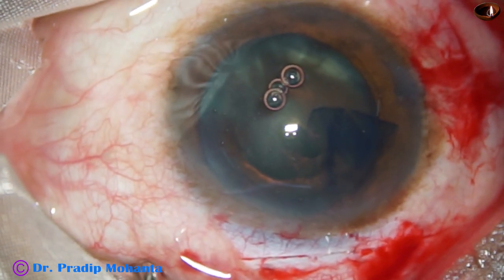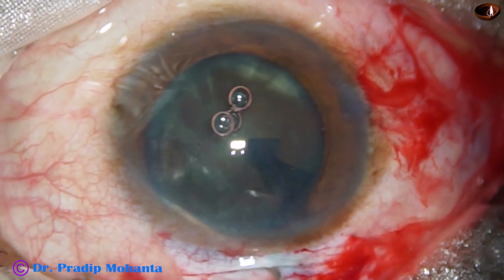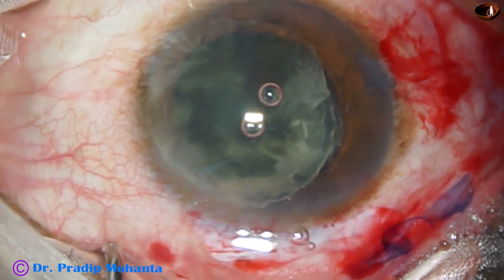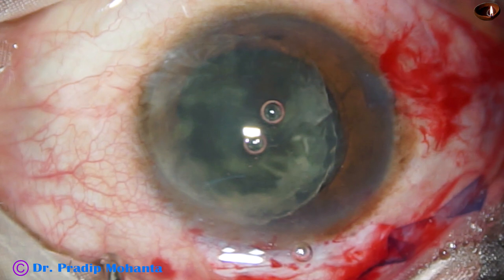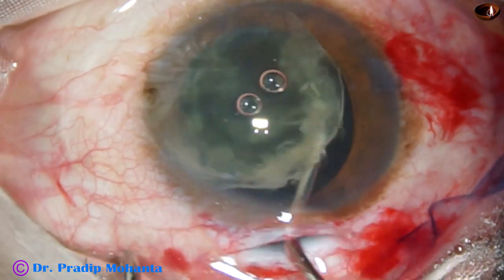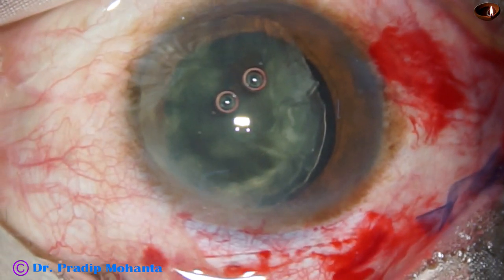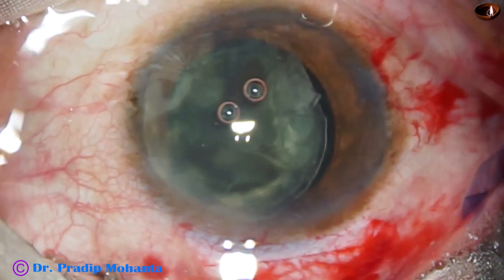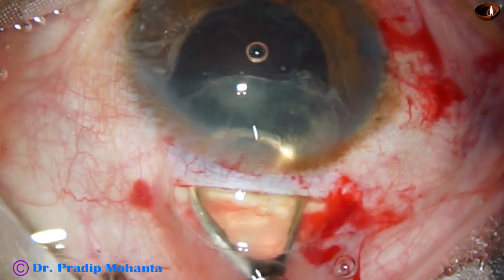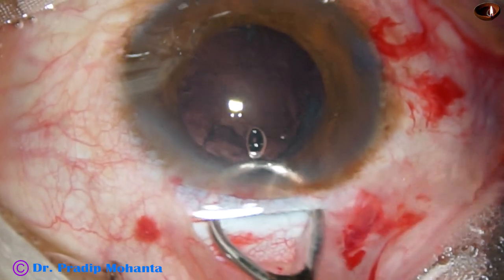Now we have to do hydrodissection and prolapse the nucleus. As we do hydrodissection, if the rhexis is of adequate size, the nucleus will prolapse in most cases. The hydrodissection cannula itself can prolapse the nucleus. Viscoelastic is injected both in front of and behind the lens mass. Now an irrigating vectus attached to a bottle at about 100 cm is used to deliver the nucleus. See how smoothly the nucleus comes out. The irrigating vectus is also used to remove the epinucleus.